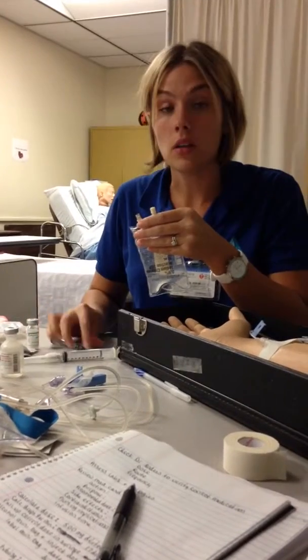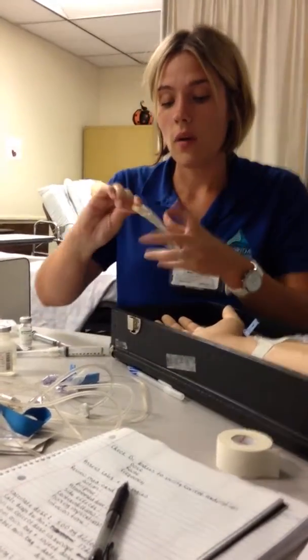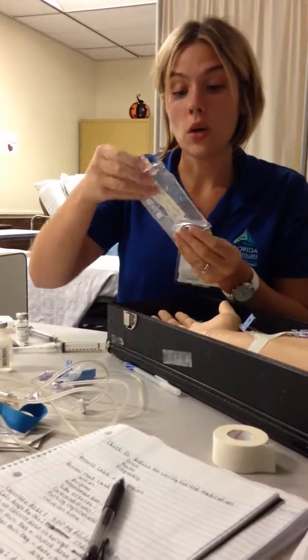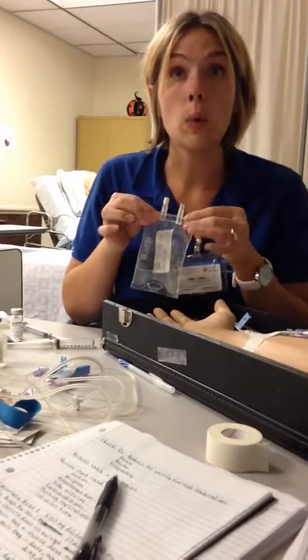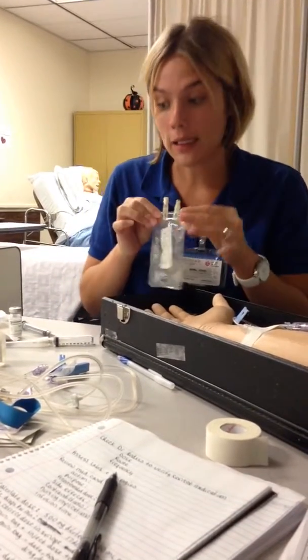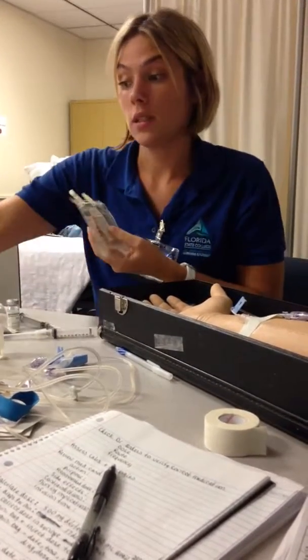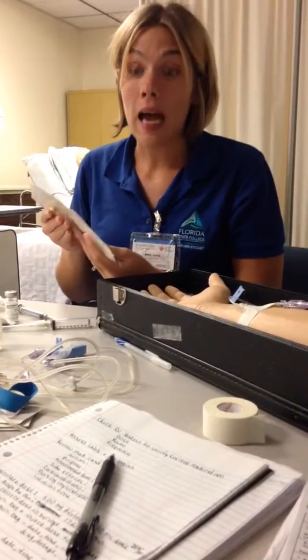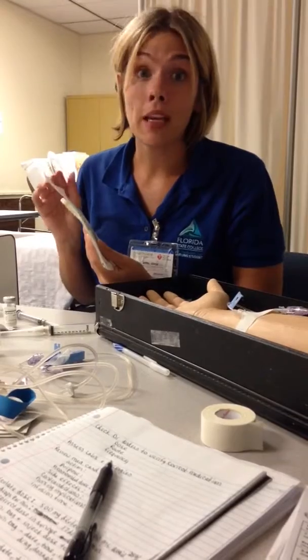This also can be done with a needleless blunt tip cannula. Now I am going to mix this in, make sure it's thoroughly in there. Also, over 1 hour, that's going to equal 17 drops per minute. I am going to label this with my client's name, drug, the dosage, the time that I'm administering it, and my initials.